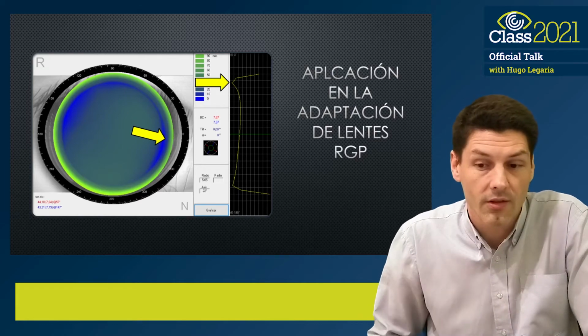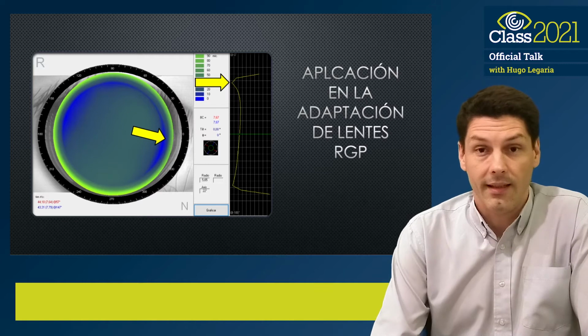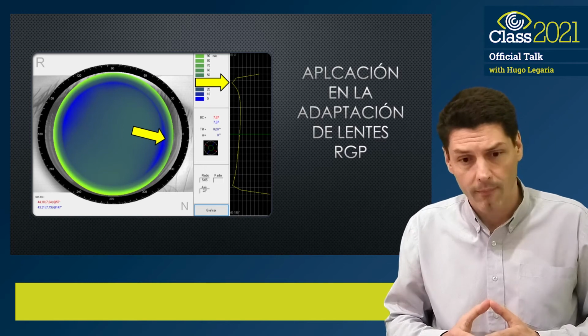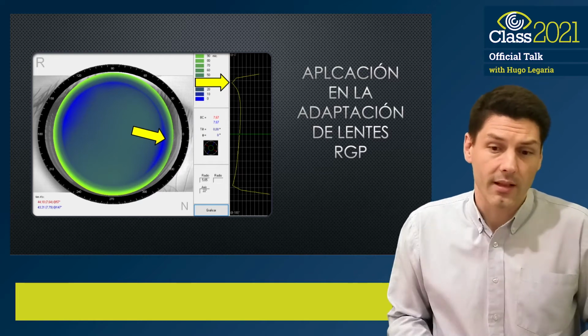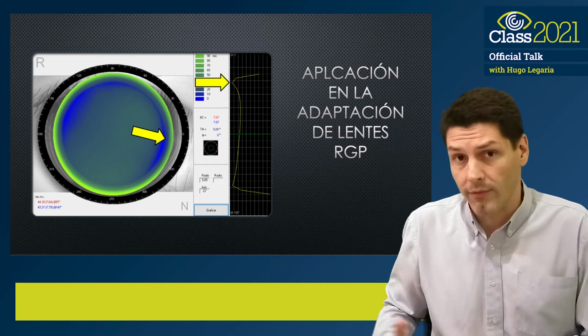Entering directly into the application of topography for lens fitting, there are two ways of working. One is through lens fitting simulation software that practically all topographers on the market have incorporated.